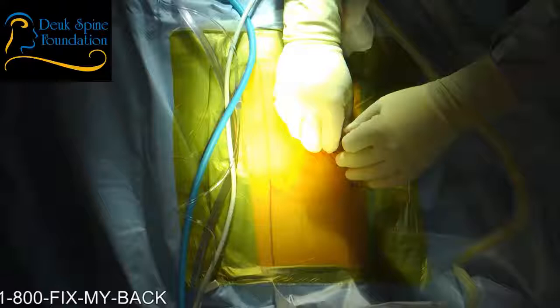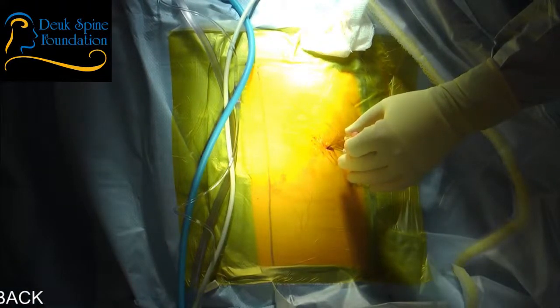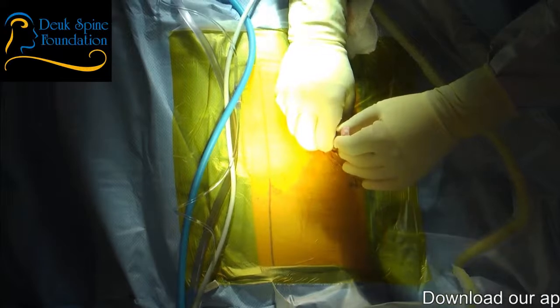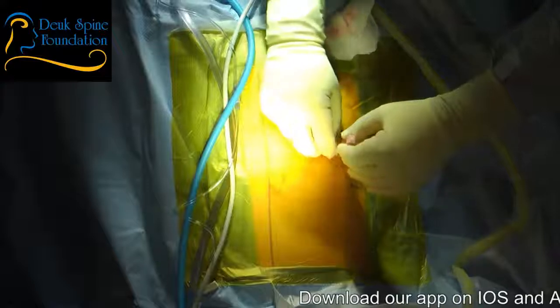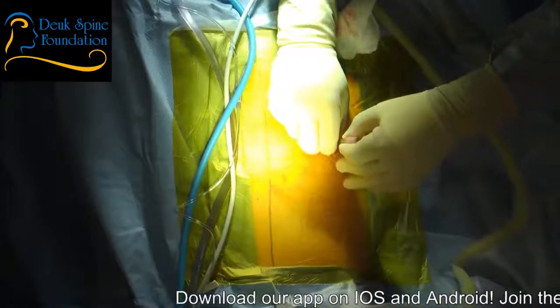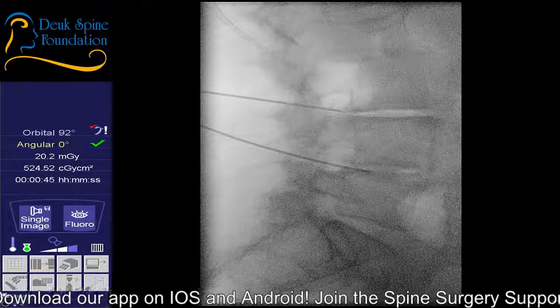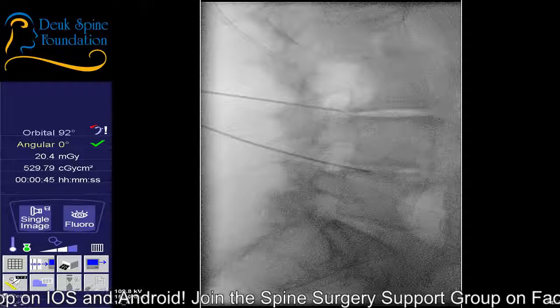I'm going in. Definitely getting in there. I'm just probably not going to be able to get a good discogram here because I'm not really in the disc as well as I'd like it to be. I'm feeling here a bone spur. It's got to be the end plate. Are you feeling anything? Pressure. Nothing going down. Yes, pressure, nothing going down.